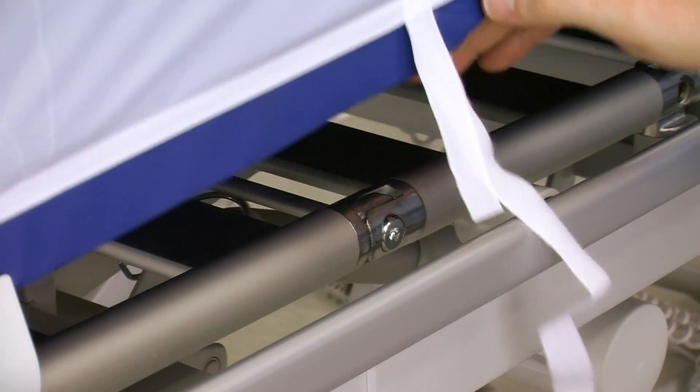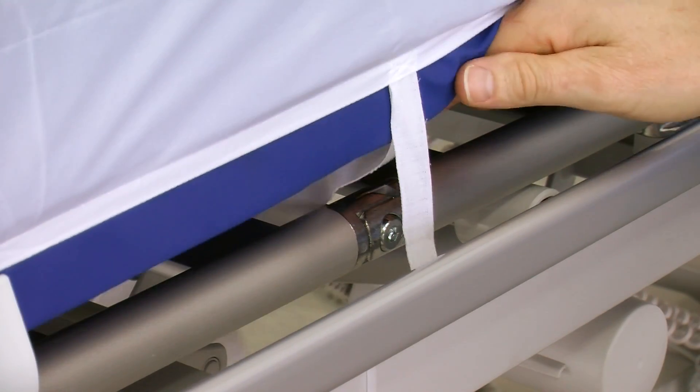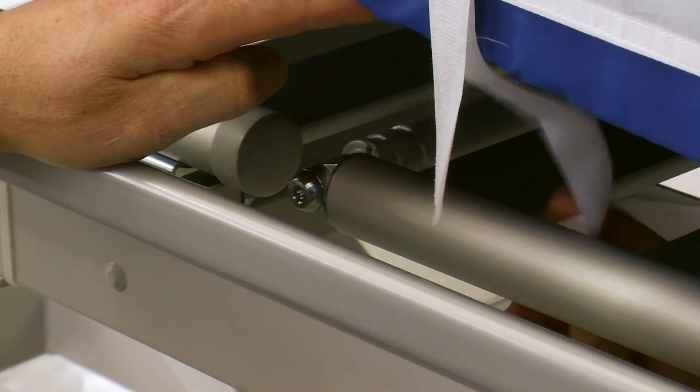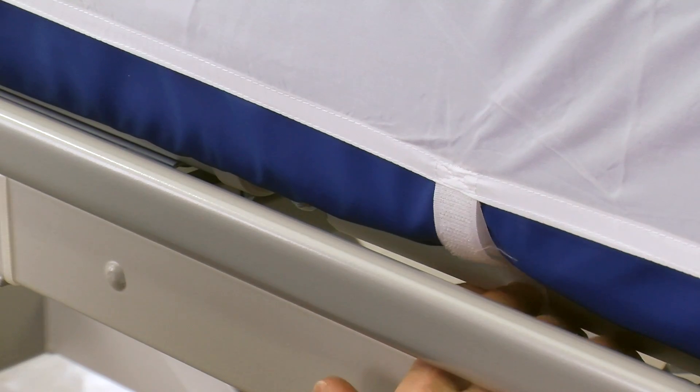Fasten the velcro tapes around the steel frame under the mattress. It is important that the tapes are mounted around the steel frame under the mattress and not around the bed frame, as the backrest, knee break, and foot section cannot be raised otherwise.